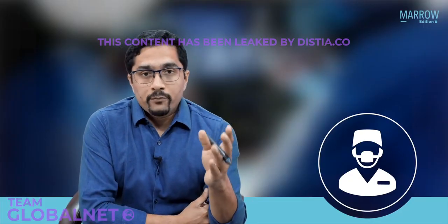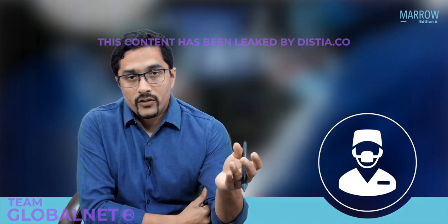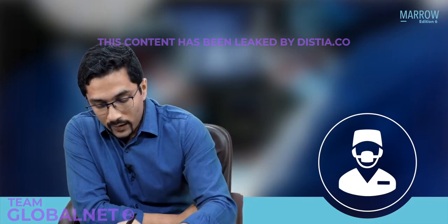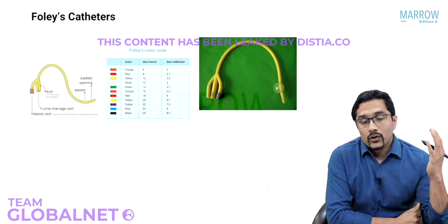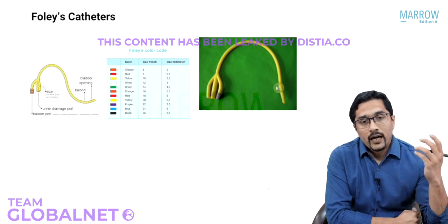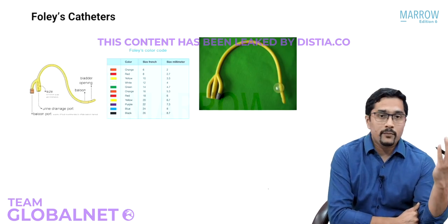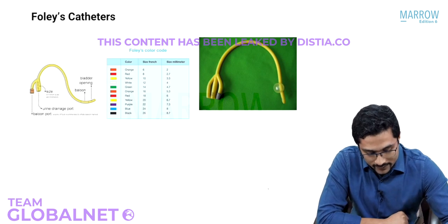Let's talk about this very important topic. Usually there's one MCQ which is asked from this topic every year in the exam. And in bladder, the first thing which I want to talk about is Foley's catheterization and Foley's catheters. So this is a very important topic. I'm sure as interns, all of you must have put catheters in both males and females. So you should know the details about a Foley's catheter.